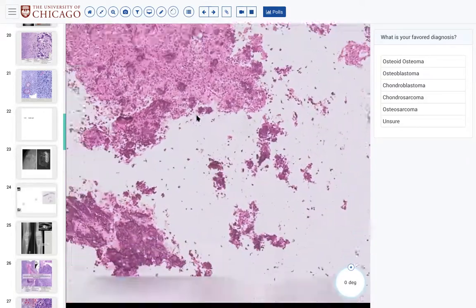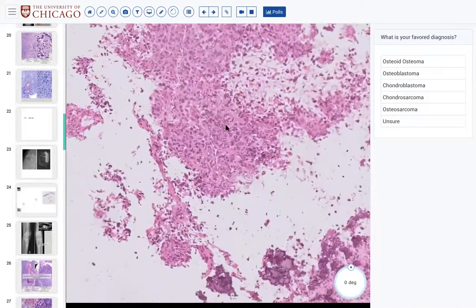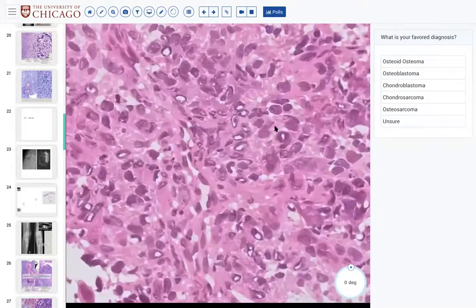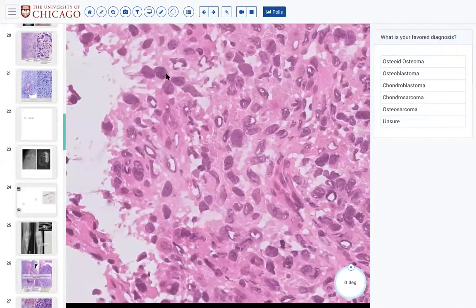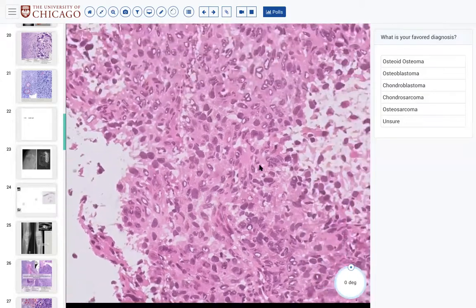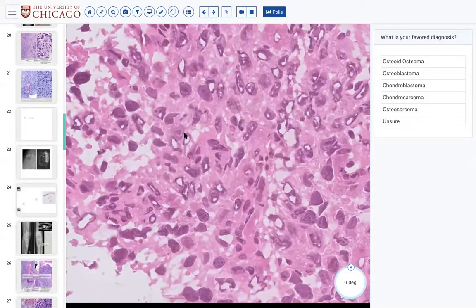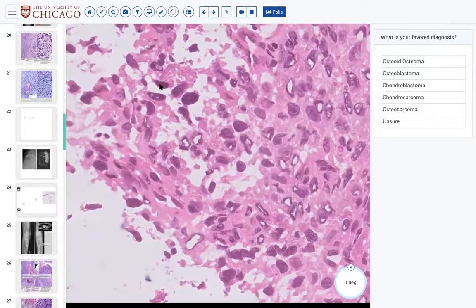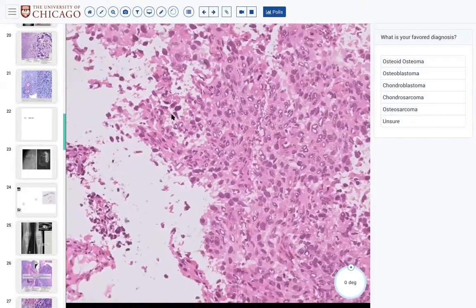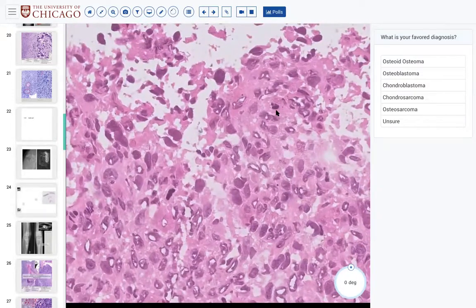But I agree, the atypia isn't hit-you-across-the-head pleomorphic. If you look at the fine, subtle nuclear features, you will see that these are plump ovoid cells, occasionally with nucleoli, occasionally with some dark chromatin, but with oddly wrinkled contours, very much overlapping. Maybe there's a red nucleolus in there. It's a little hard to say, but here's a very hyperchromatic cell. Here's another hyperchromatic cell. And yep, that might be a mitosis right there. Actually, there might be two in this field.